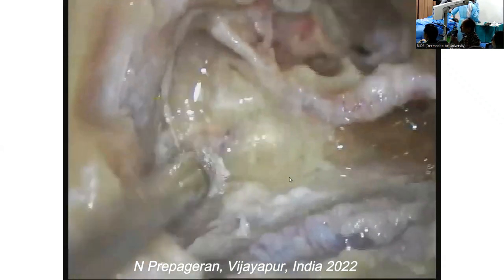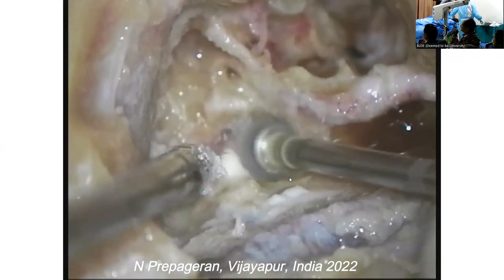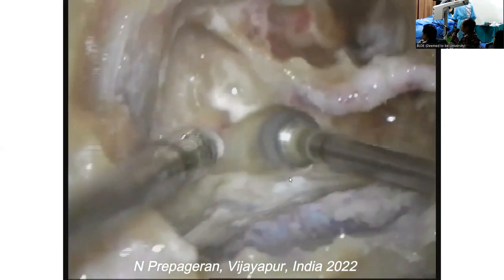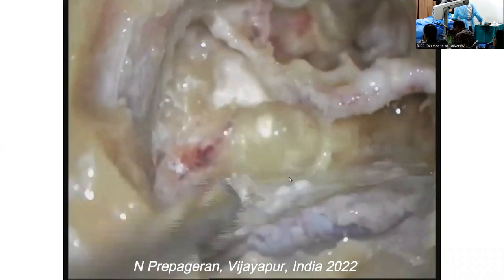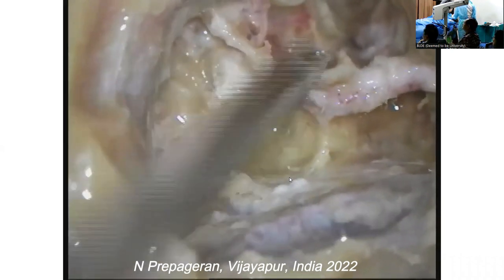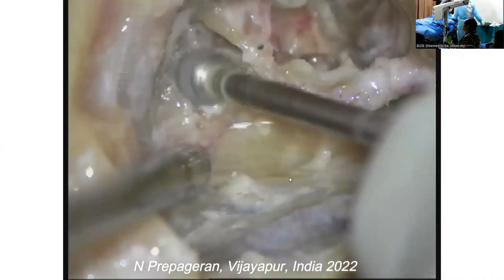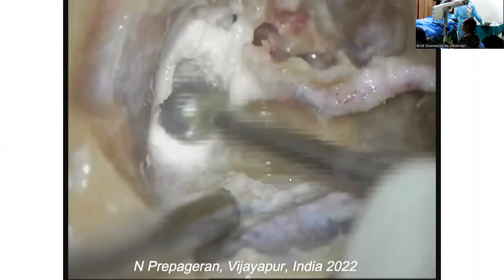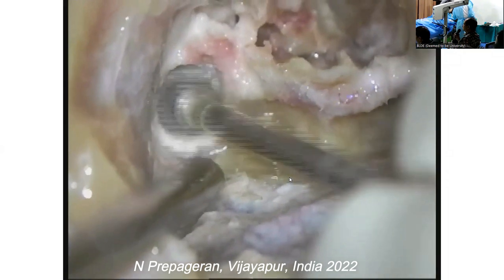It's wobbly, right? So now we're going to open the posterior there. He's opening the posterior here. The burr is a bit big, but never mind. We finish faster, I guess. So once you've opened this up, you want to open the superior. See, it's so big. Can you see? You don't have a smaller one, I guess.